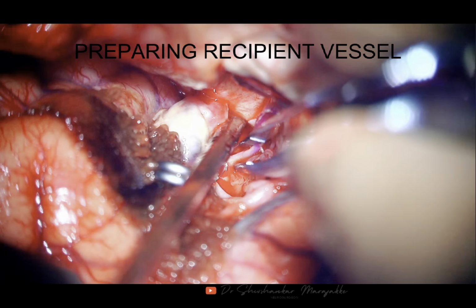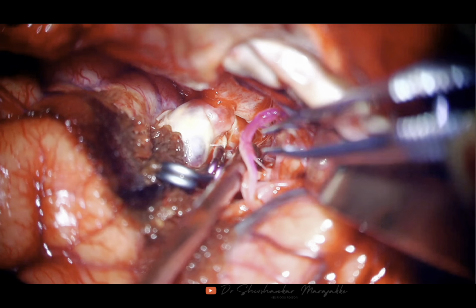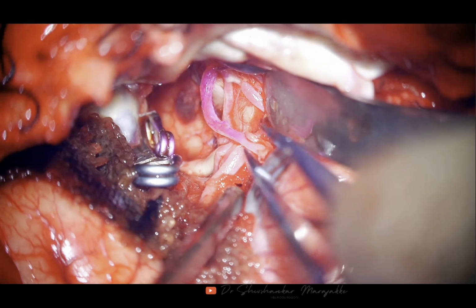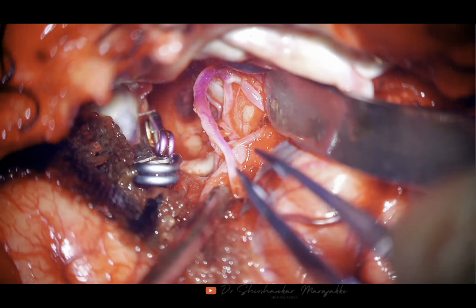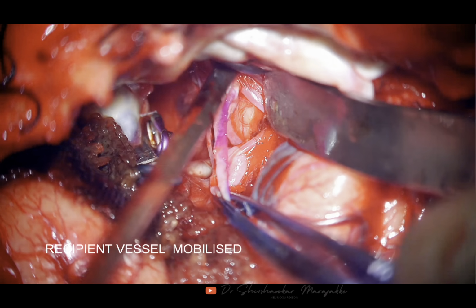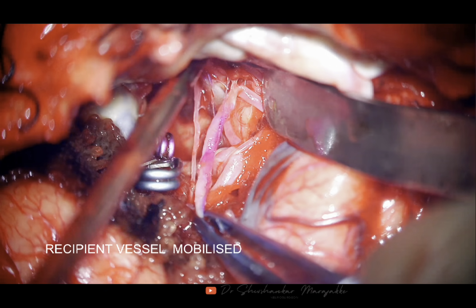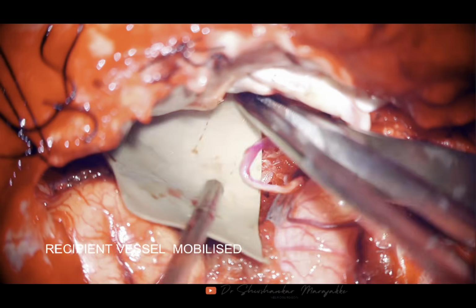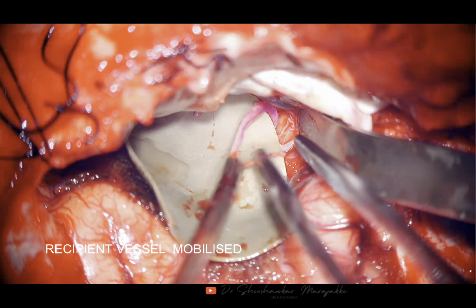So the antetemporal artery is divided now, and I am bringing it up into the sylvian fissure so that it will be easy for me to anastomose here rather than down in the deep medial part of the sylvian fissure. That is the antetemporal artery, quite a large one. So I am preparing for anastomosis. This is a dam which is kept over here.